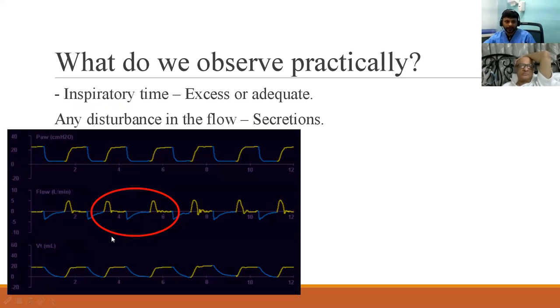Here in this particular scalar, if you see, the baby's inspiration is long over. There is a long phase of no flow in the breath and then there is an expiratory phase. If you look at the pressure scalar with the same breath, the pressure is lifted up. This is the PIP, the peak inspiratory pressure, which has been held for a very long time without any flow.